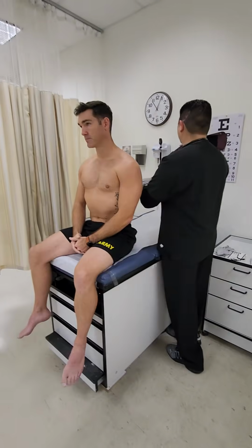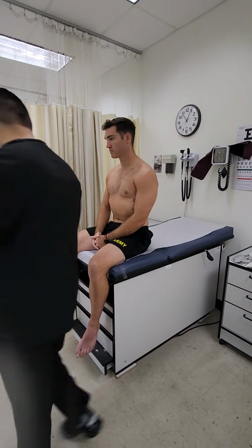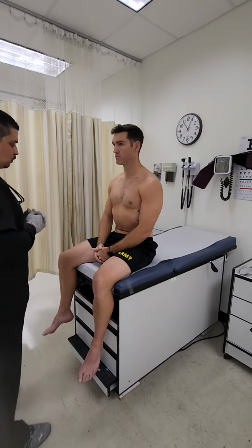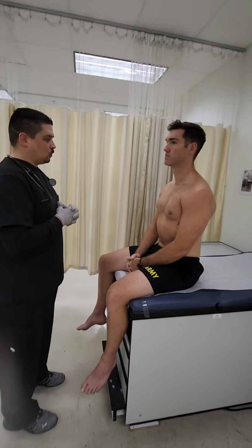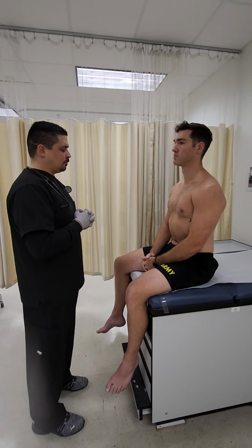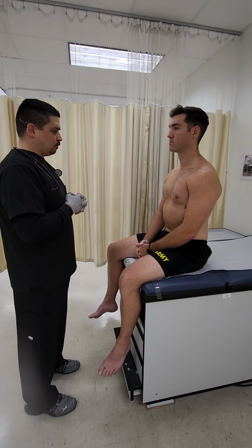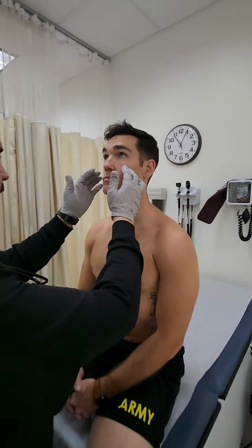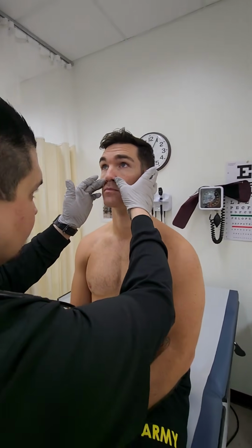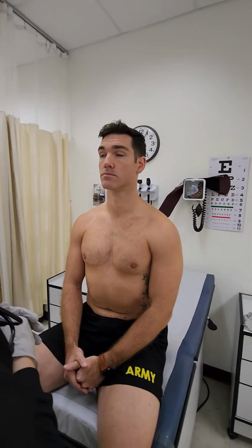Verbalize. Bilaterally. No swelling, redness, or obstruction. Pearly gray and translucent. Light reflex is anterior inferior quadrant. Landmarks undistorted. No fluid behind TMs, and TMs are mobile. Now begins nose and sinus examination. Begin by inspecting the nose. Look up for me a little bit. Okay. Verbalize. Nose is midline and without lesions.